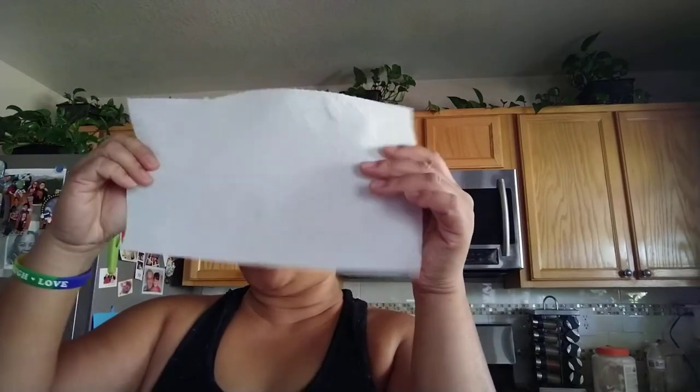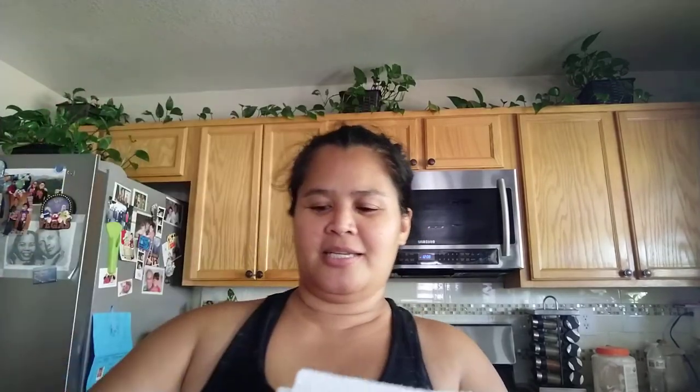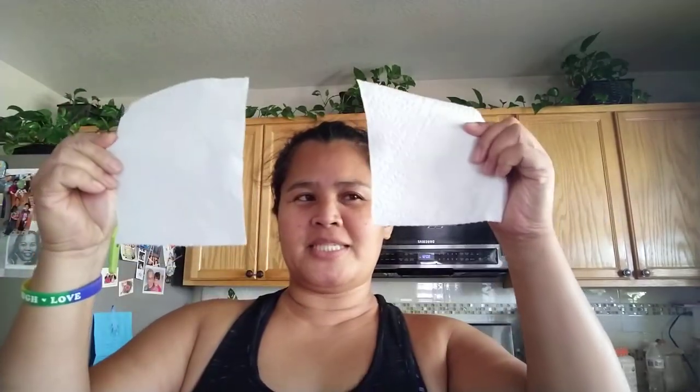If you put your contact lens in the morning and take it out in the evening, you use two pieces — one in the morning and one in the evening. That's a lot just to put your contact lens. Now with this idea, from one piece you get two pieces — one morning and one evening — so I save a lot of paper towel. This is how you do it, guys.